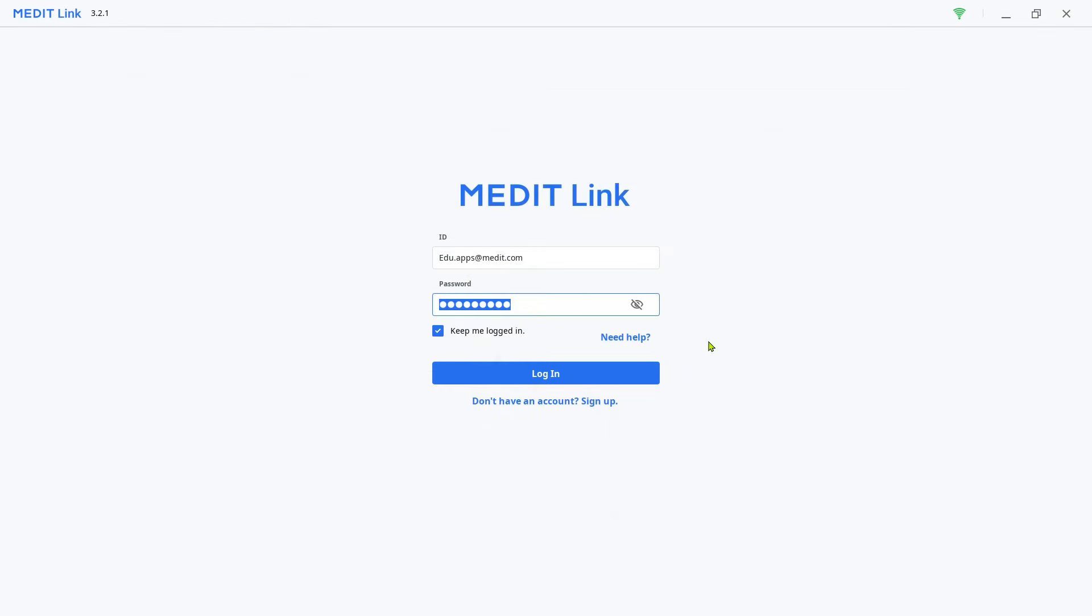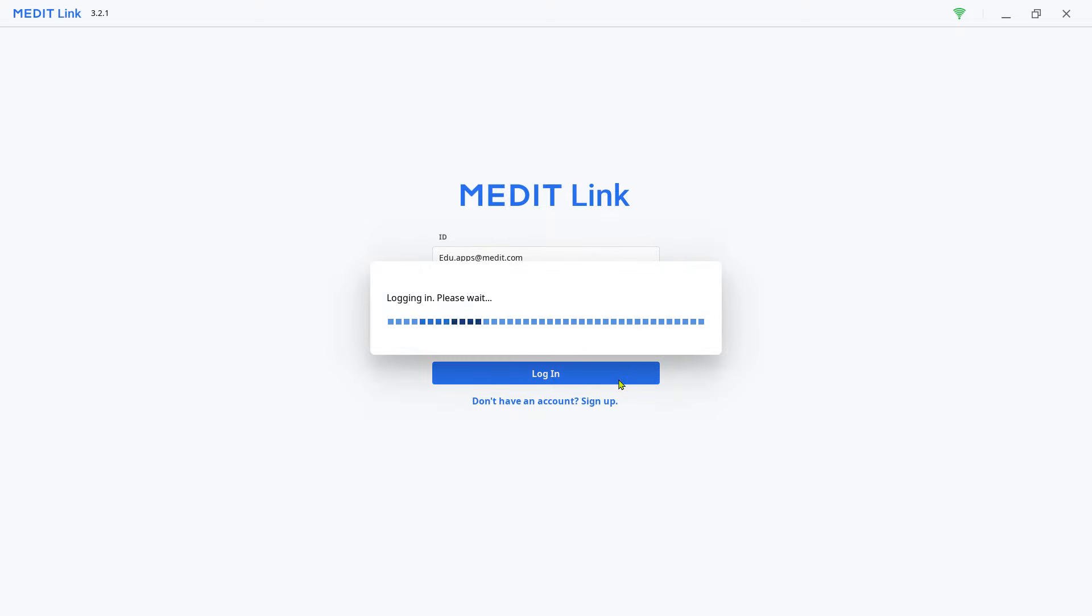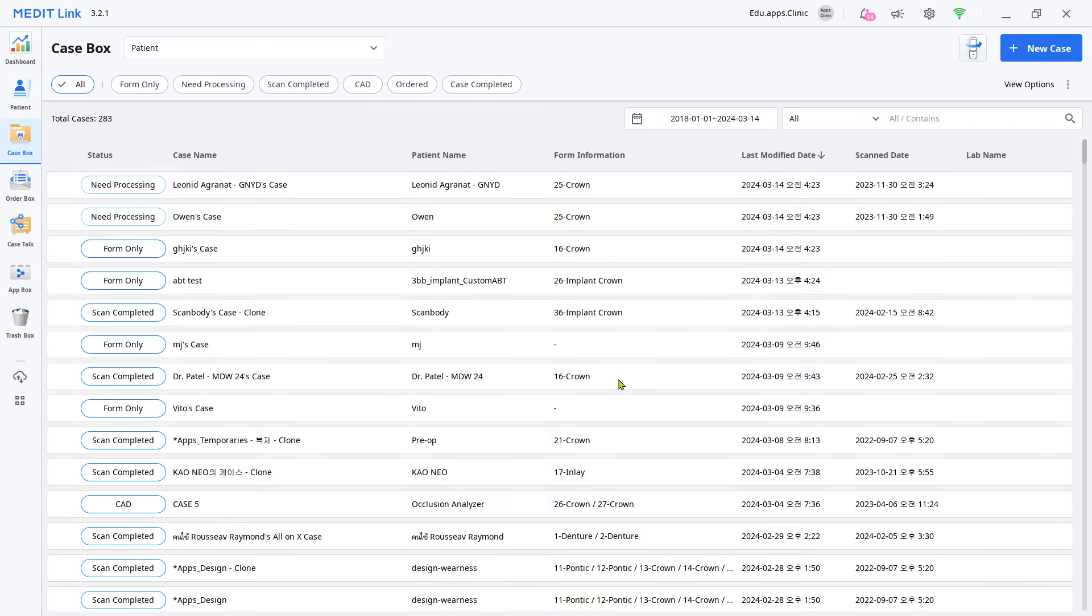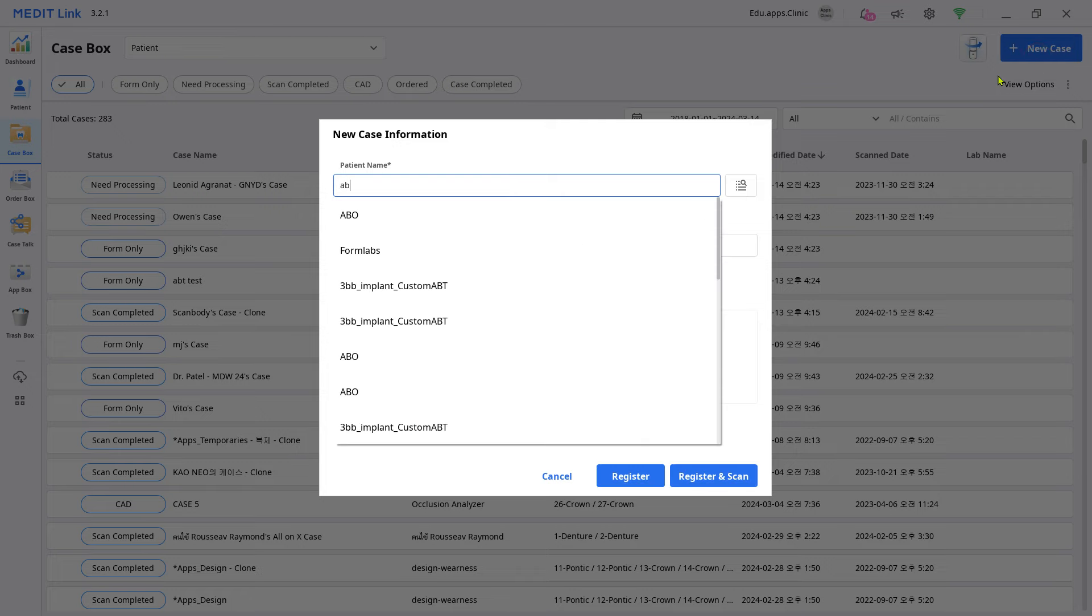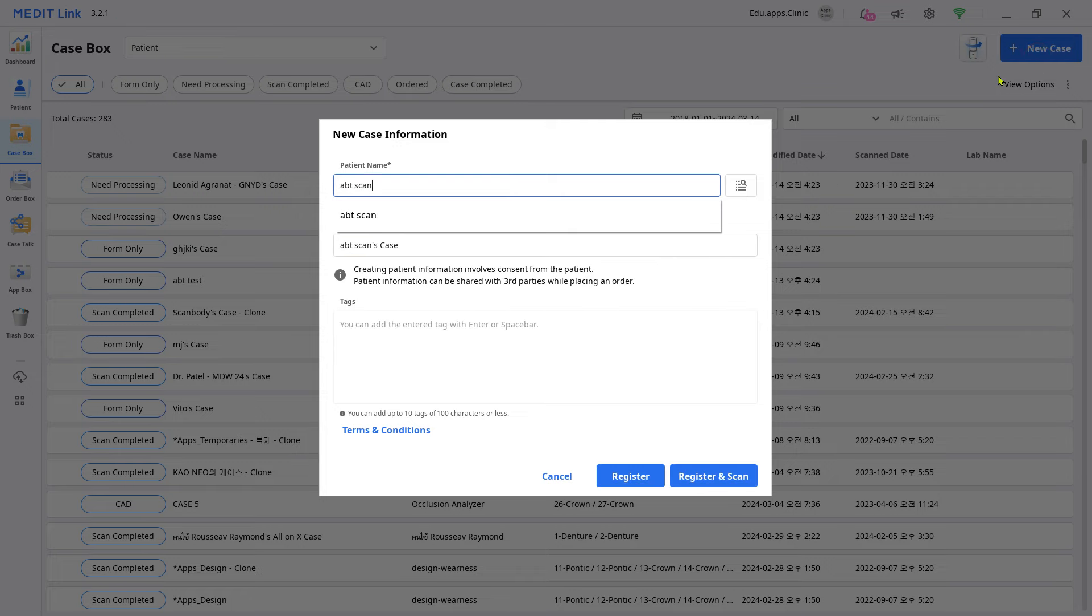Now let's scan. Log in to your MeditLink account and create a new case. Input the case information and click register and scan.